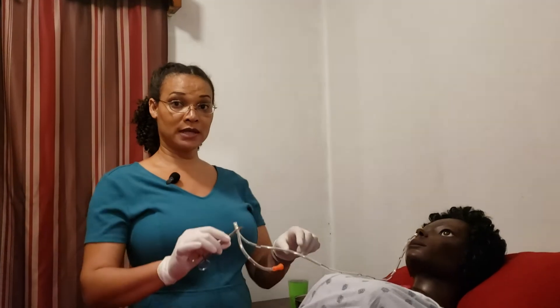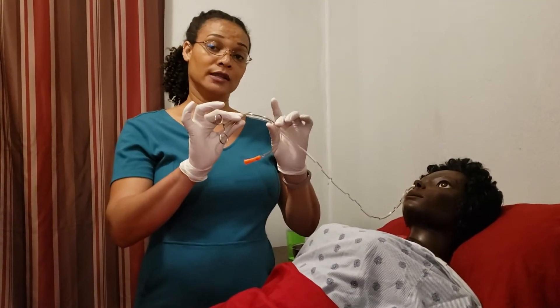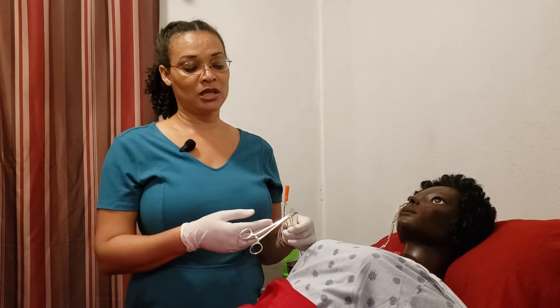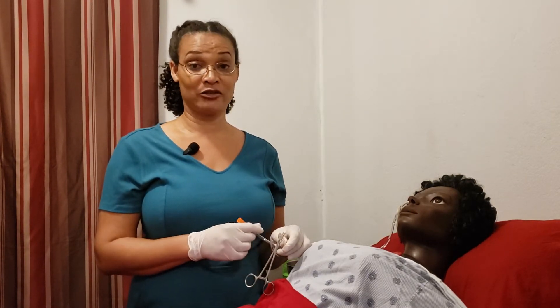In most cases, you will notice that the feeding tube is clamped off. We clamp off the feeding tube because we want to ensure that the patient does not have an excess amount of air entering the stomach, as it can cause abdominal distension.